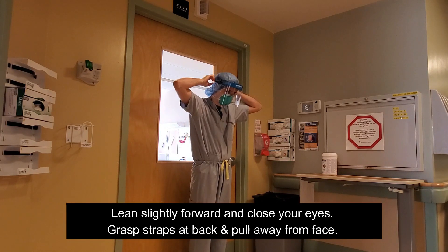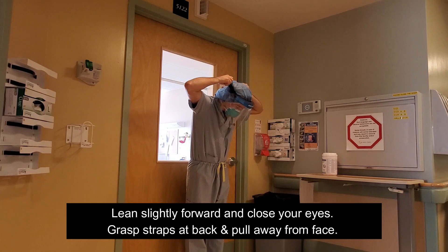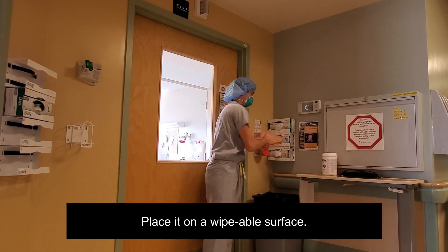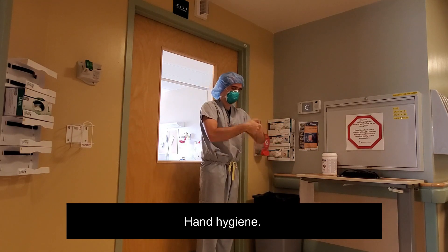Remove the face shield by leaning slightly forward and closing your eyes. Grasp the back straps and pull the shield away from the face. Place it on a wipeable surface. Perform hand hygiene.